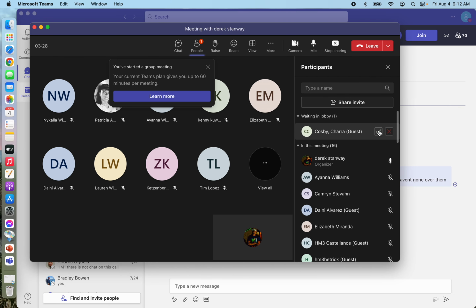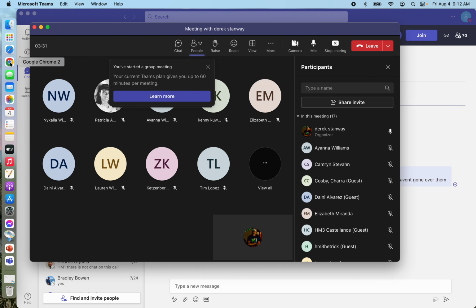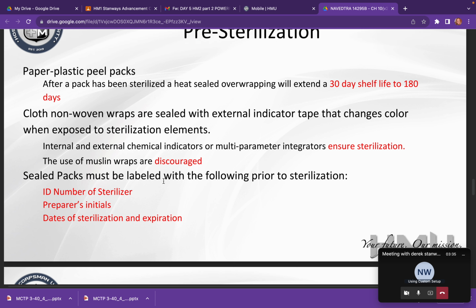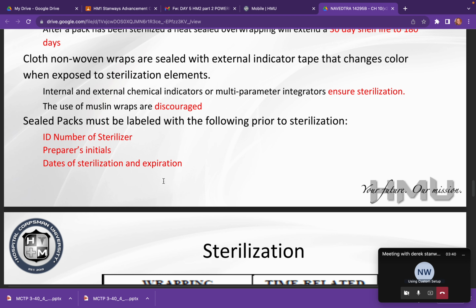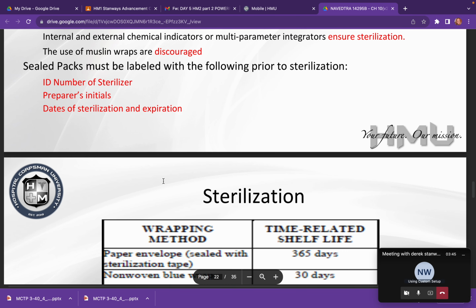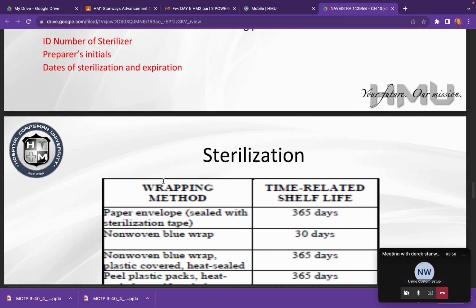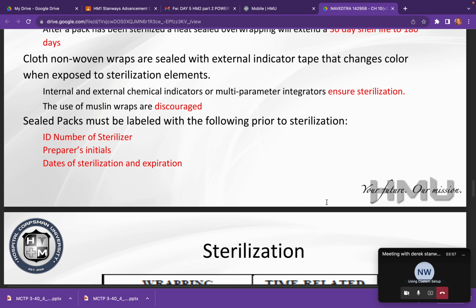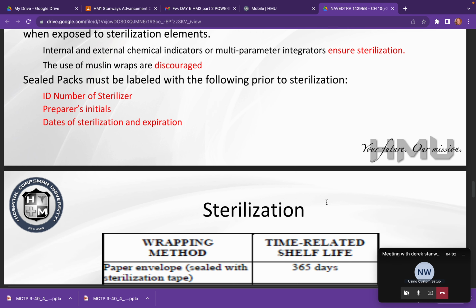I'm surprised you don't have the lot number and the batch number for the labeling. It should be. That is definitely something that you need. With that lot number and or batch number in addition to those other elements, it allows you to fact check, go back and figure out if there was an error with the individual or if there was an error with the sterilizer itself. Because if that's the case, you have to go back and recall all instrumentation, all packages that have that same lot number and ensure that it was properly sterilized.